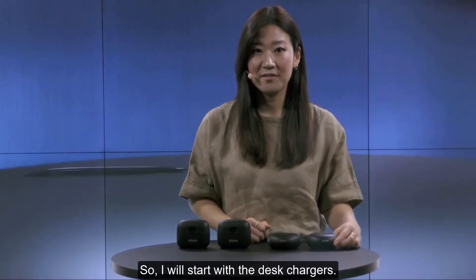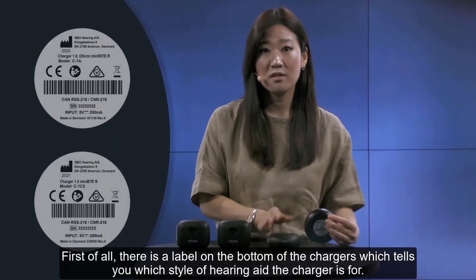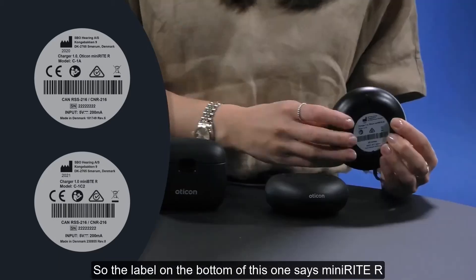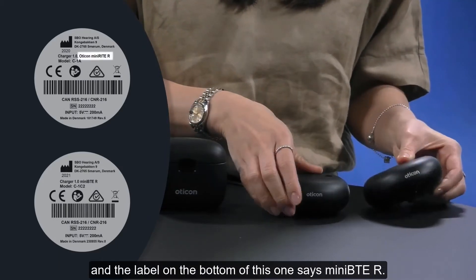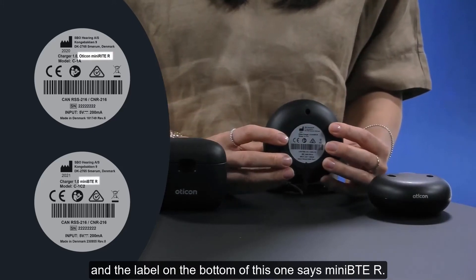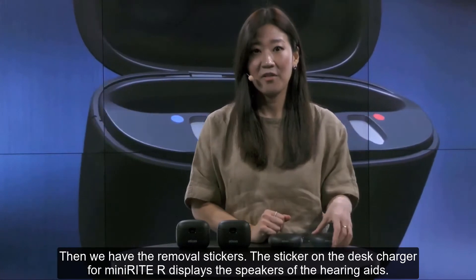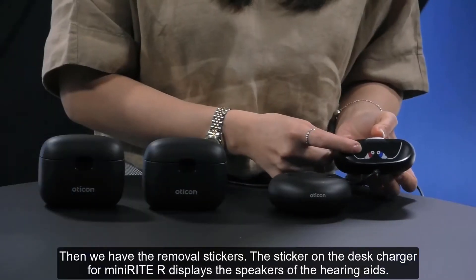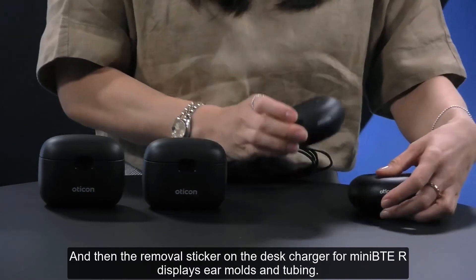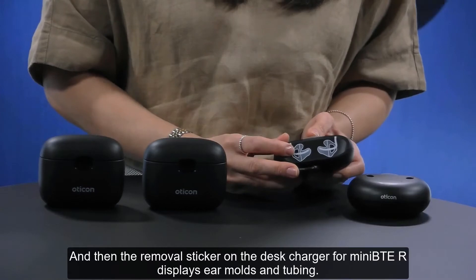Starting with the desk chargers: first, there is a label on the bottom of each charger which tells you which style of hearing aid it is for. The label on this one says Minirite R and the label on this one says Mini-BTE R. Then we have the removable stickers. The sticker on the desk charger for Minirite R displays the speakers of the hearing aids, and the removable sticker on the desk charger for Mini-BTE R displays ear molds and tubing.